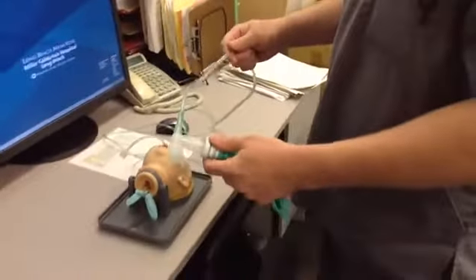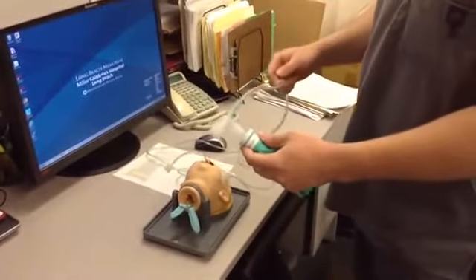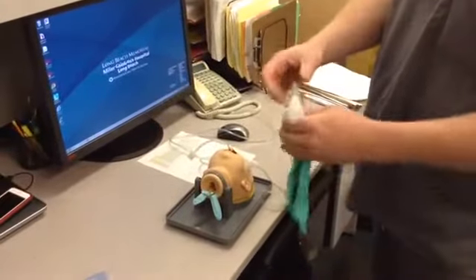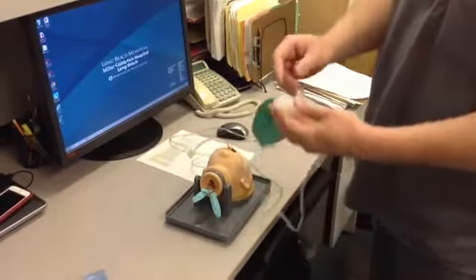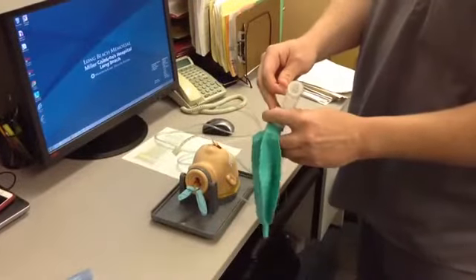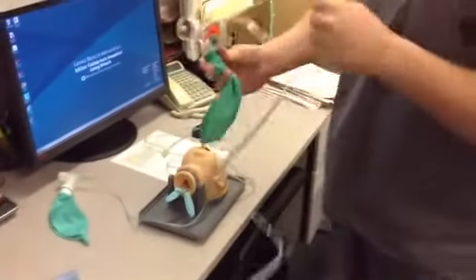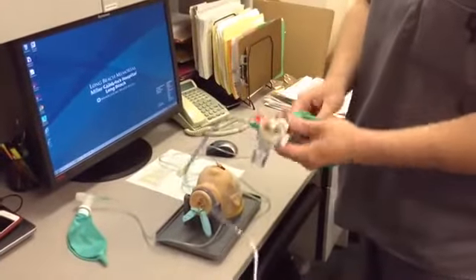This is the old bag. This is the bag that we have been using for many years here. It's a very basic bag. Standard ½ liter. It's got an oxygen inlet and a place to place a pressure line. Very simple bag. The new bag has a couple of the same features.